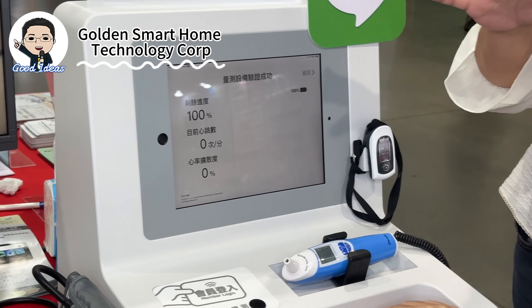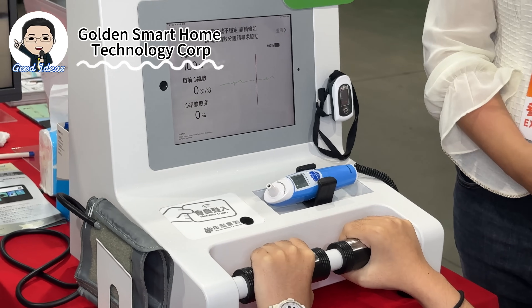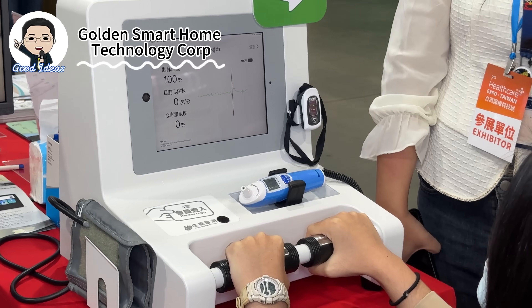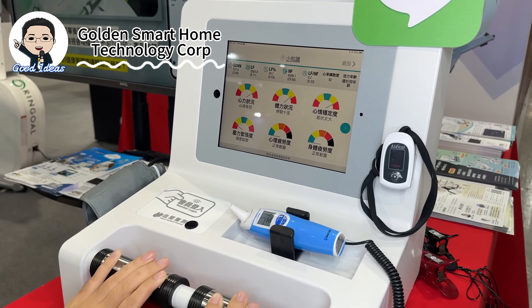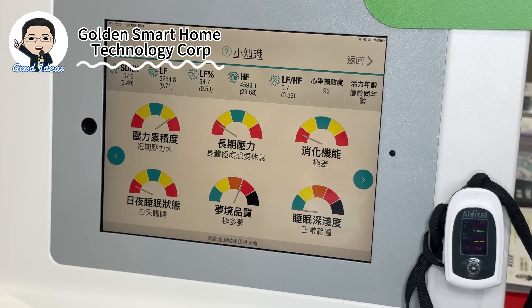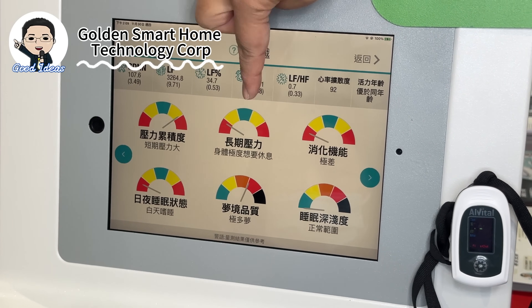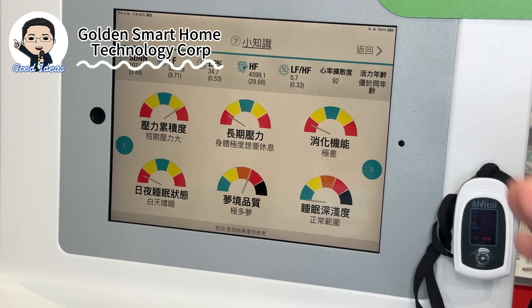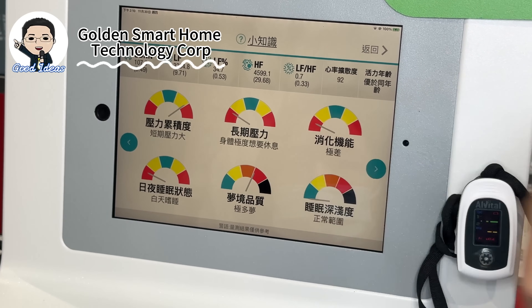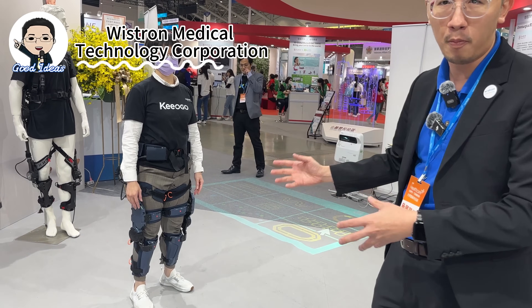Now we're going to introduce another star product. It can show the healthy degree for your pressure — your short-term pressure for two to three months, or long-term pressure for around six months. Looking at her index, the green and blue parts are more balanced and normal, but her measurement this time shows she needs rest.